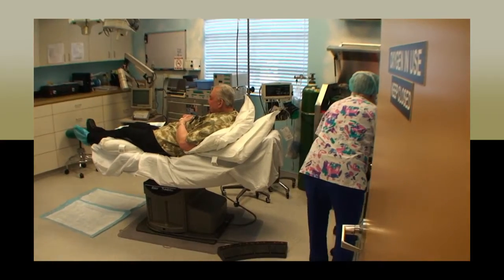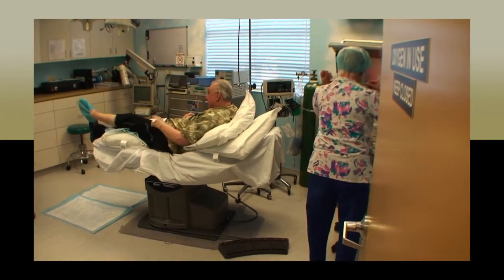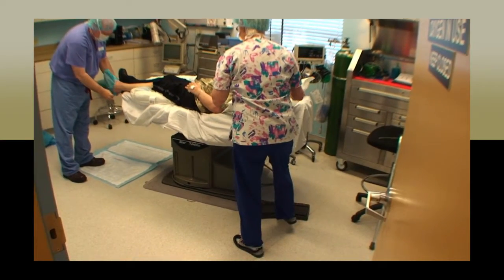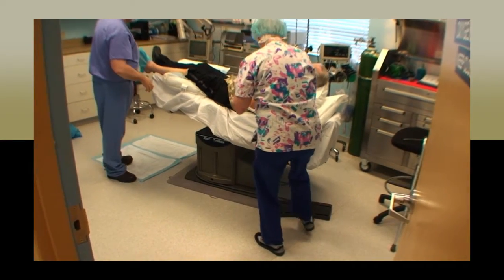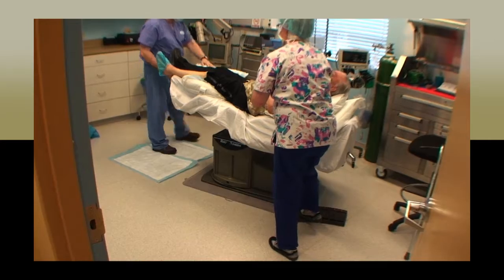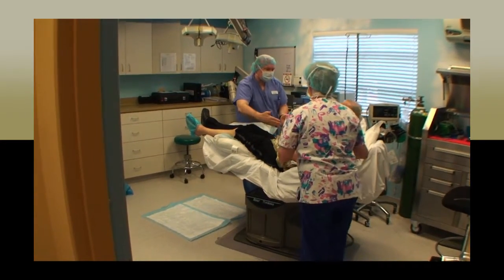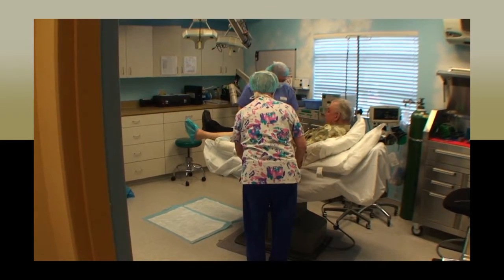If they chose to wear sweatpants, you will need to roll up the leg completely past the knee. Check to make sure that the leg exposed is the correct leg for surgery. You should see an X or initials on the proper foot to be operated on. You will need to verbally confirm with the patient and the staff in the room using the chart that this is the correct foot or ankle.